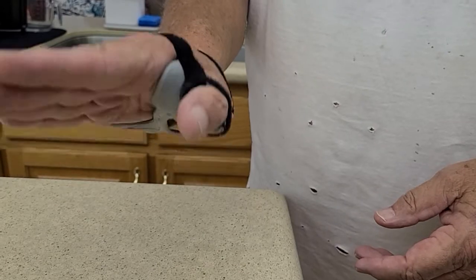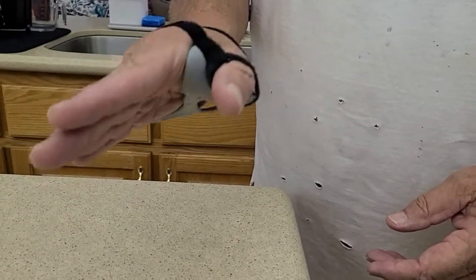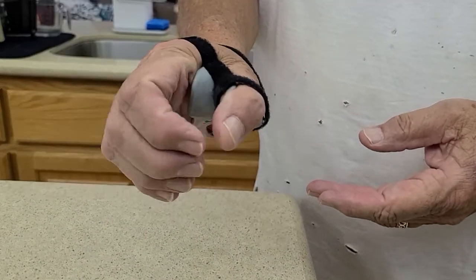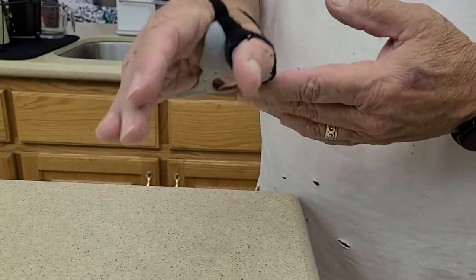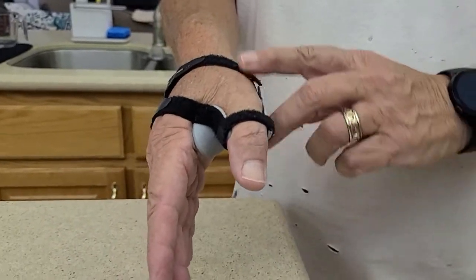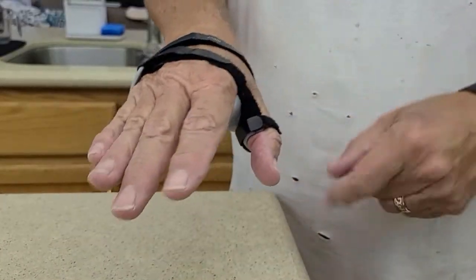It keeps your hand from — you can't really pinch your fingers — but it supports your thumb out here. So you can still grip stuff this way, but it doesn't let you force your knuckle, your joint in here. That's the main thing, and it gives you support across it so it supports it better.